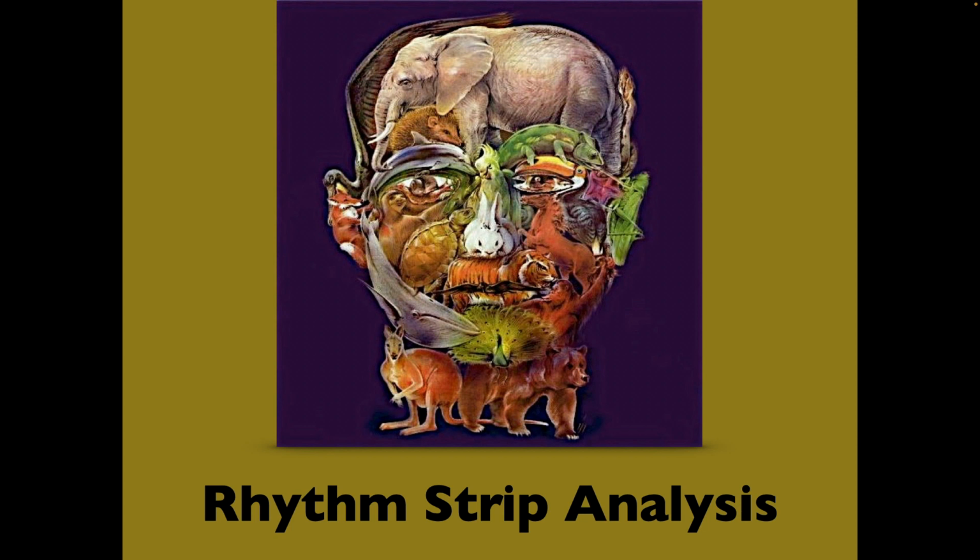So Koa, where does the PR interval begin and where does it end? Beginning of the P wave going on to the QRS, so that's like 3 to 5 boxes. Oh, perfect, you answered 2 questions for the price of 1. Another way to say that would be from the beginning of atrial depolarization to the beginning of ventricular depolarization. And Andrew, when Koa says 3 to 5 small boxes, how would you say that in seconds? A normal PR interval is 0.12 to 0.2 seconds. Correct.